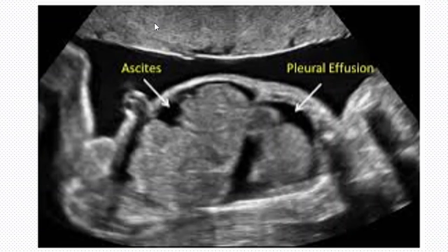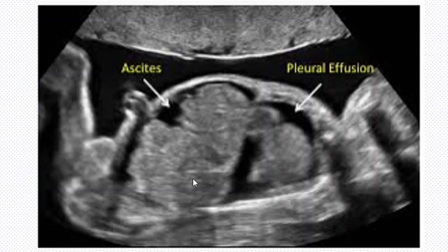This is the placenta. What you are seeing here, which is anechoic — the anechoic space — this is our amniotic fluid. You can see nicely here the insertion of the umbilical cord and the umbilicus of the fetus. If you make an assessment of the fetal abdomen, you can see these are the bowels, and you can see there is fluid in the peritoneal space — what we call ascites.